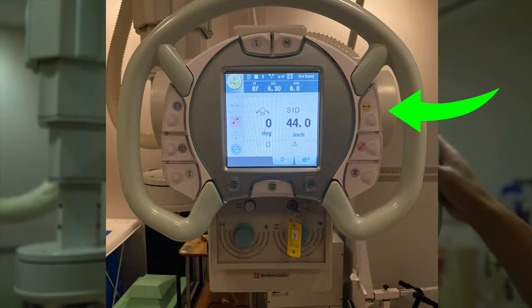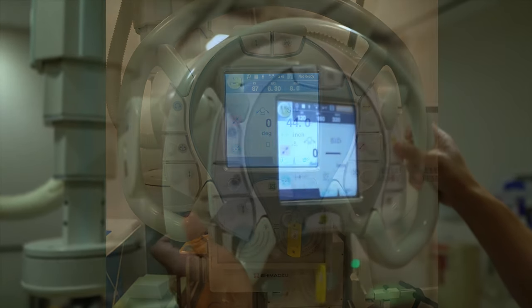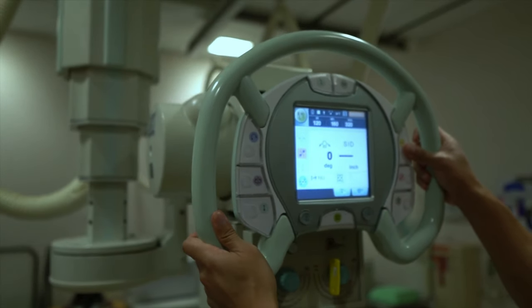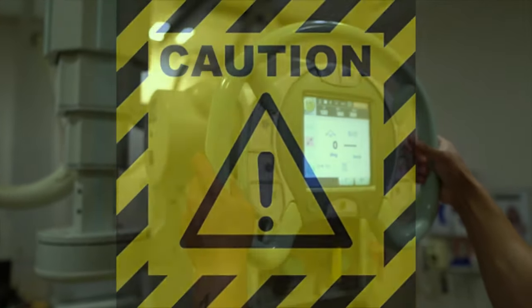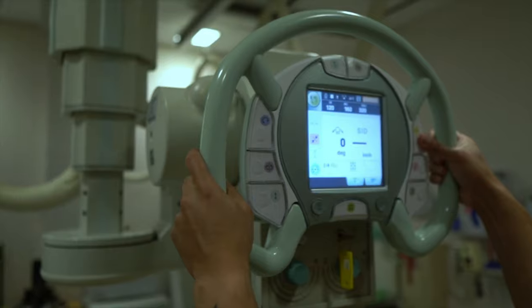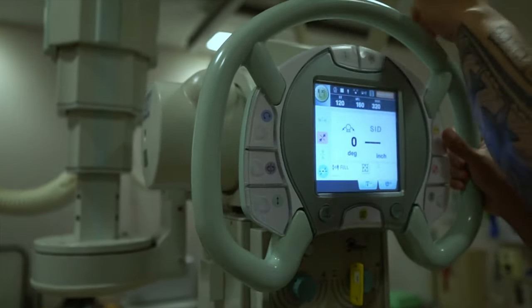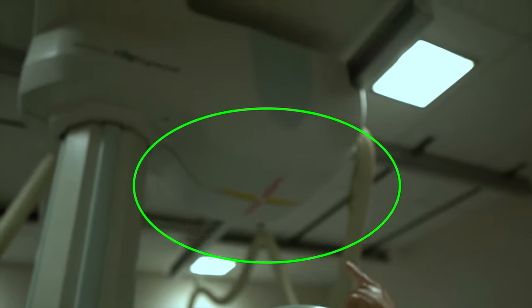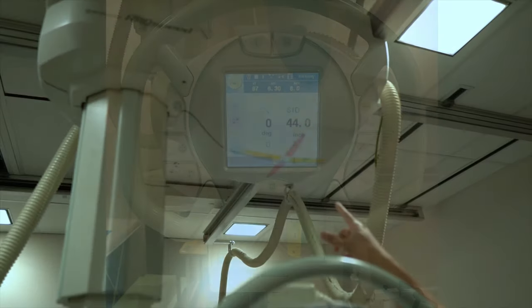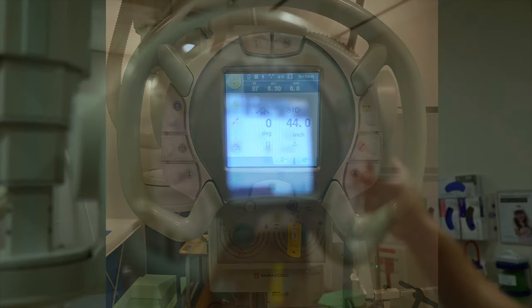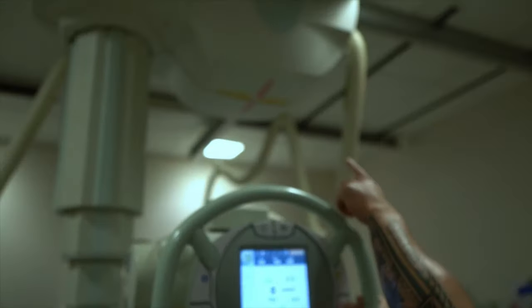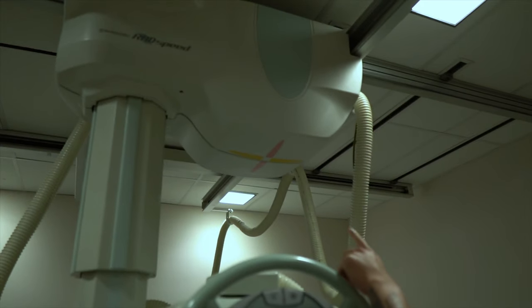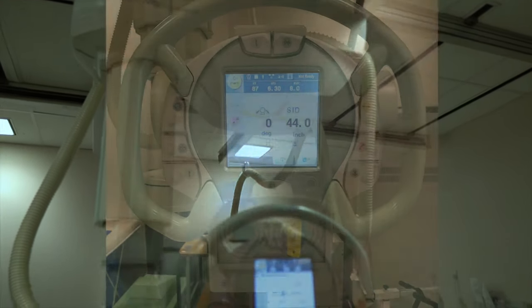Next is the longitudinal button, which allows you to bring your tube across the length of the table. To remember which way the yellow button moves the tube, I think of yellow as caution — the tube is moving side to side. There are markings on the ceiling to help as well. The next button is the transverse button, allowing you to bring your tube across the width of the table. I remember this as danger, which is red — the tube is coming right at you or the table.